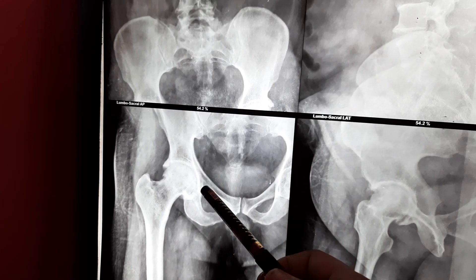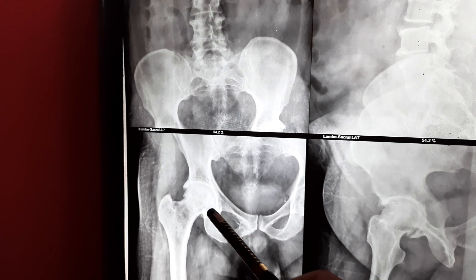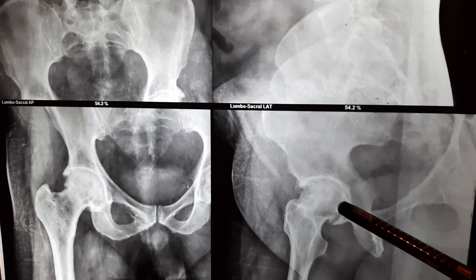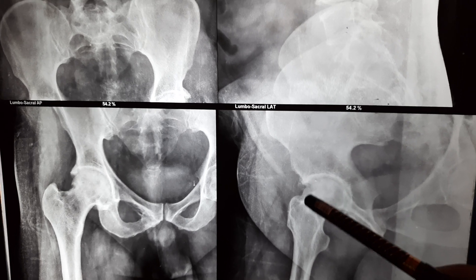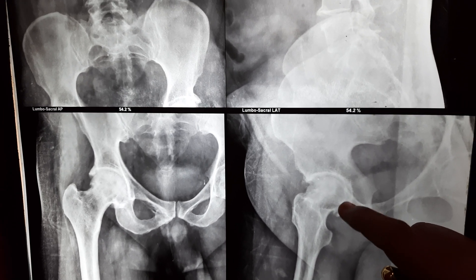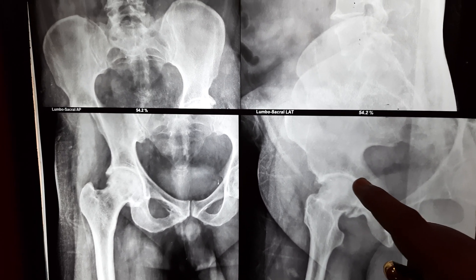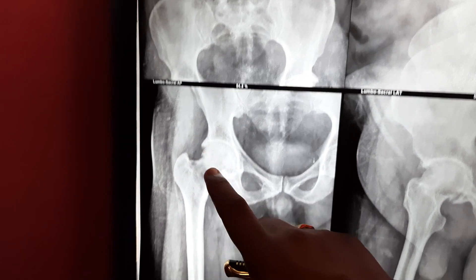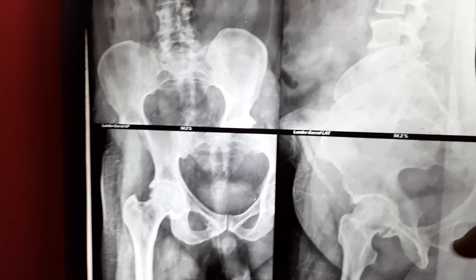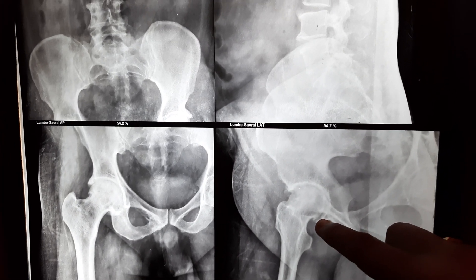Now coming to the hip region — as mentioned, the patient was having difficulty with rotational motion of the hip. That is why we asked for an X-ray of the hip. Here we can see the head of the femur has degenerated, and we can see sclerotic changes at the level of each hip joint. On the right side hip, the sclerotic changes are clearly visible.